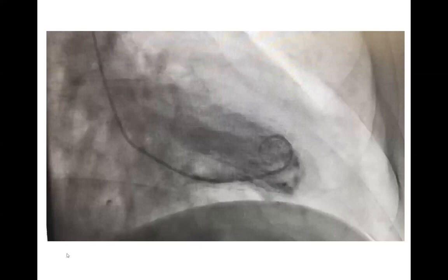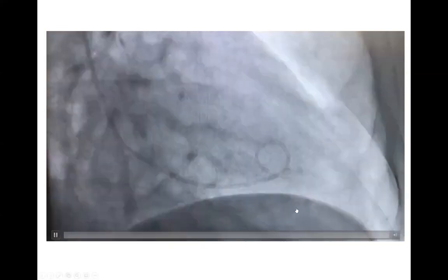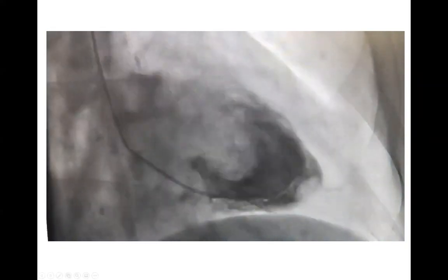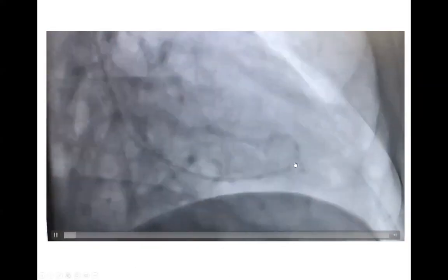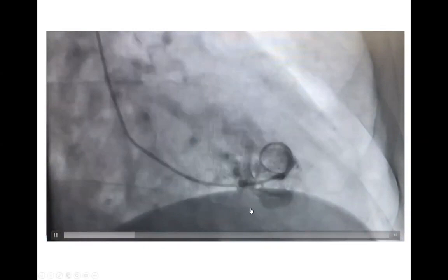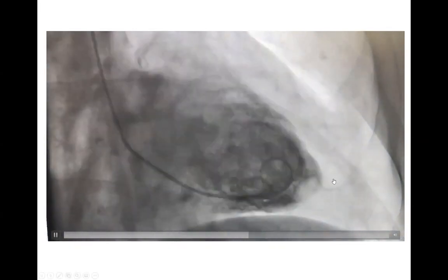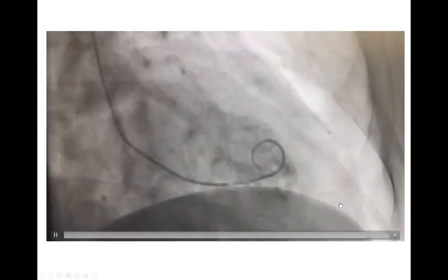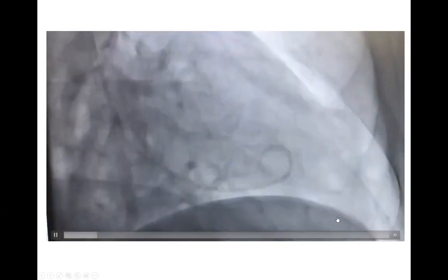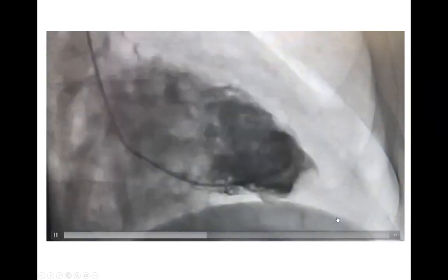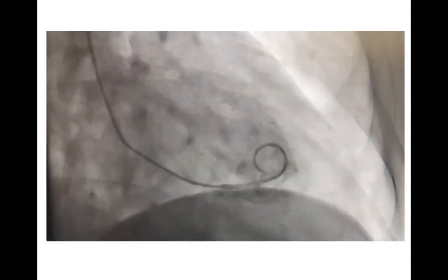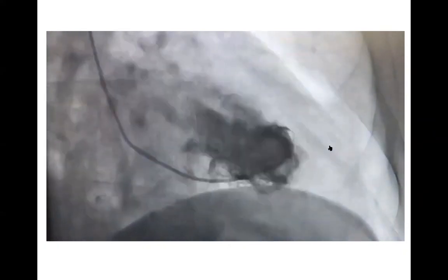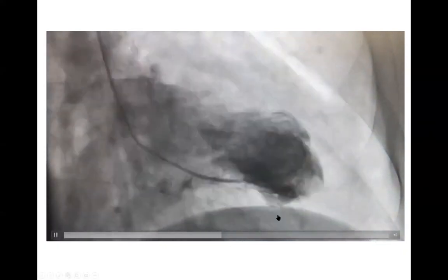What is interesting on that LV gram? Do you see anything? To me, it looks like the basal sections of the heart are moving more than the apex. It is true, because the apex has a problem.